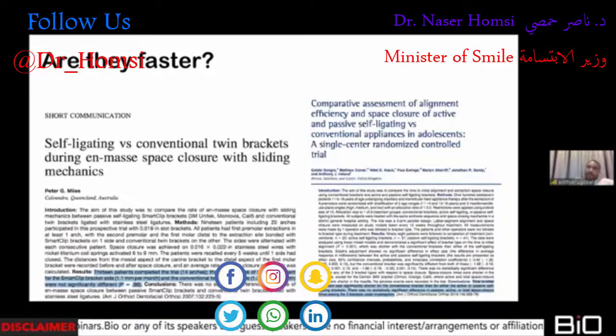Now, let's debunk the second very important question over here. Are they faster? There are some studies, especially Dr. Miles is an authority on this subject. He has so many papers published, especially when it comes to self-ligation, conventional, the speed and the friction and the aesthetics and all these things. And he has concluded in one of his landmark papers, self-ligating versus conventional twin brackets during en masse space closure with sliding mechanics. 13 patients completed the trial. The median rates of tooth movement for SmartClip, which he used, were 1.1 millimeter per month, and conventional twin bracket was 1.2 millimeter per month.